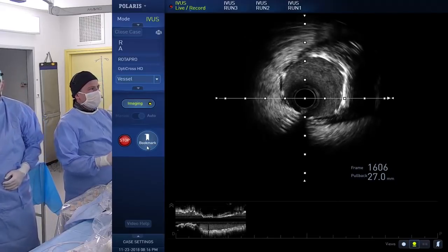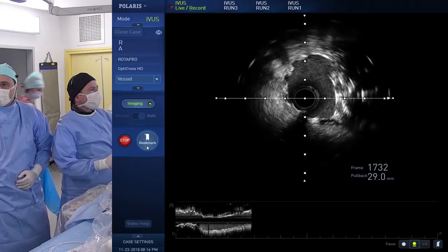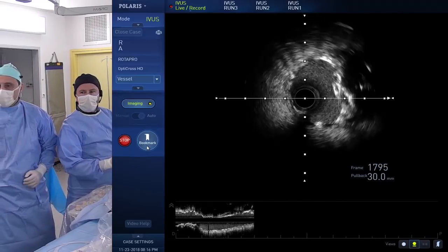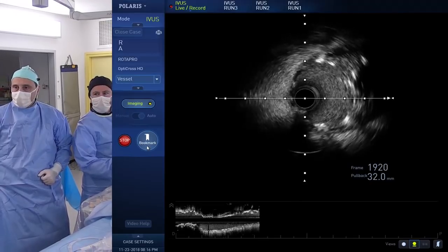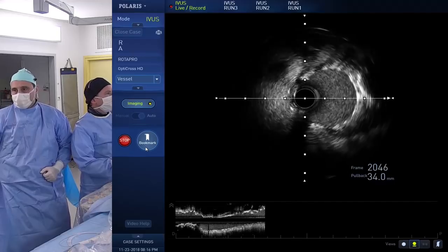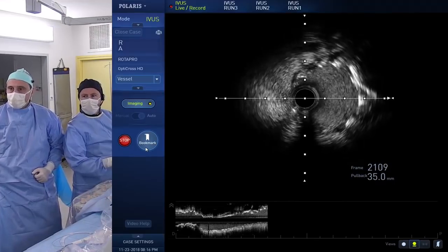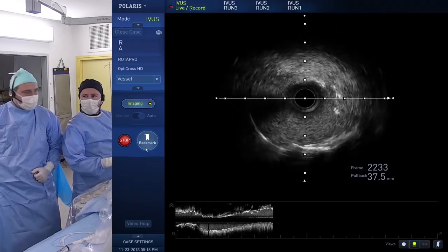Do you have it? Yes. We're admiring it. Yeah, of course, it's an illusion to think that we will have a perfectly circular stent. Let's not forget that the amount of plaque and calcification was extremely eccentric. So I think having a well-apposed stent with a good diameter overall will be more than a decent result.